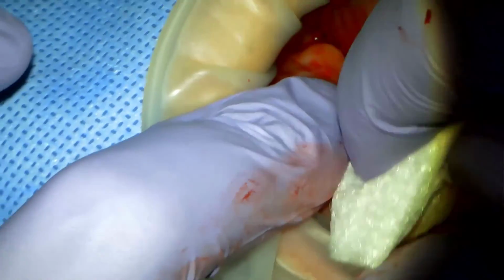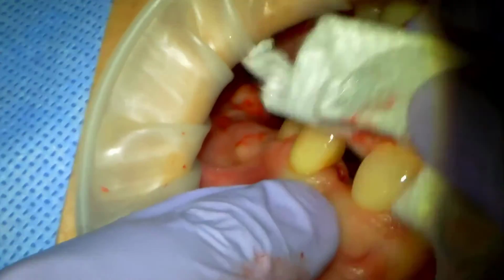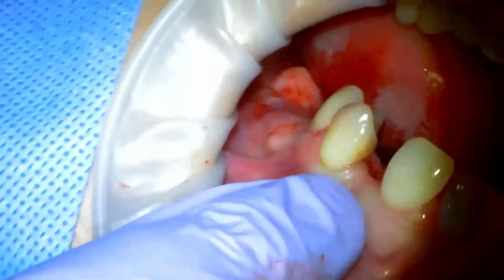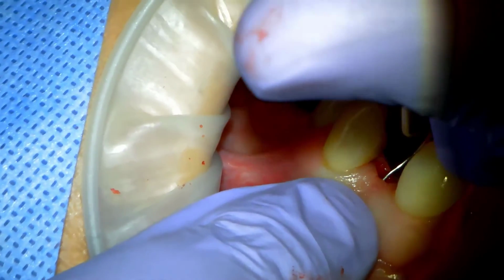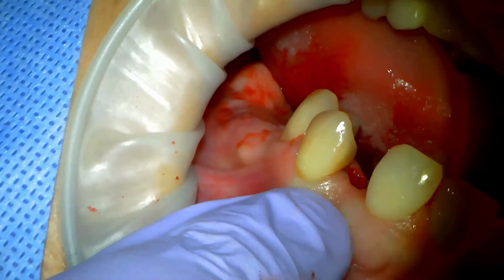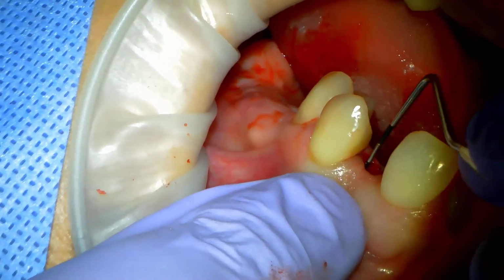I'm evaluating now our surgical site. First thing I like to do is take an Explorer and just make sure I feel bone all the way around the top of the implant. So I find the implant, go to the top, make sure I'm going to use a perio probe to get over this central.